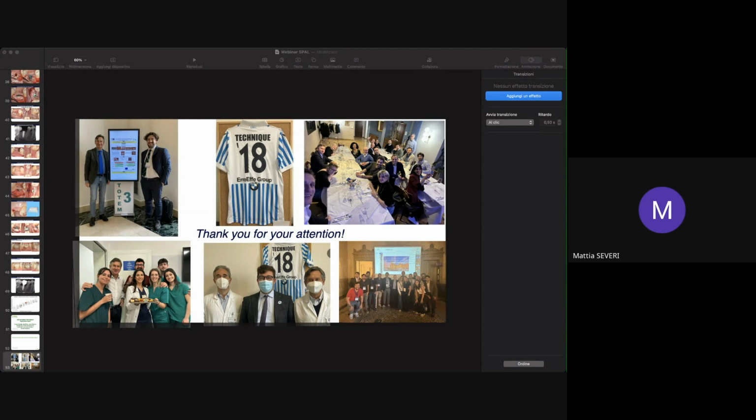We have no data on how much we can augment in a pre-implant procedure, since this technique was thought out and performed in order to correct peri-implant bone dehiscence at the time of implant placement. Maybe we have some suggestion from Steigmann. If you want to look at a similar technique performed to increase the thickness of an edentulous crest using periosteum, you can refer to the article by Steigmann, 2012 or 2015, where he combined the use of a periosteal pouch and a collagen membrane in order to increase the thickness of a bony crest prior to implant placement.